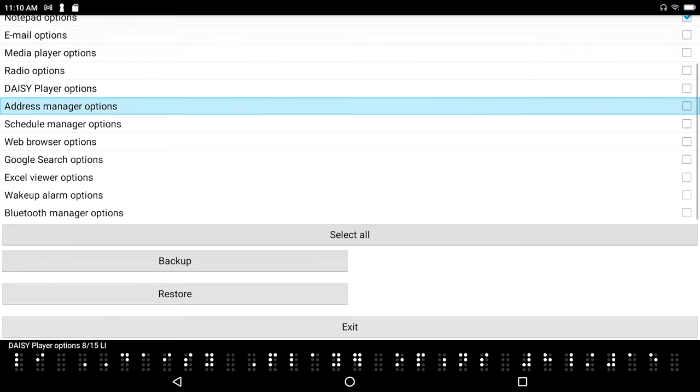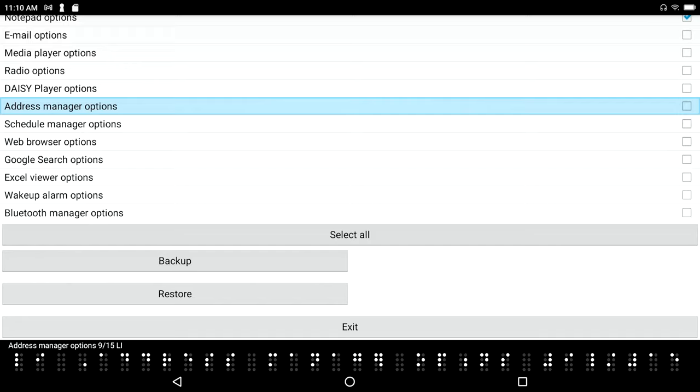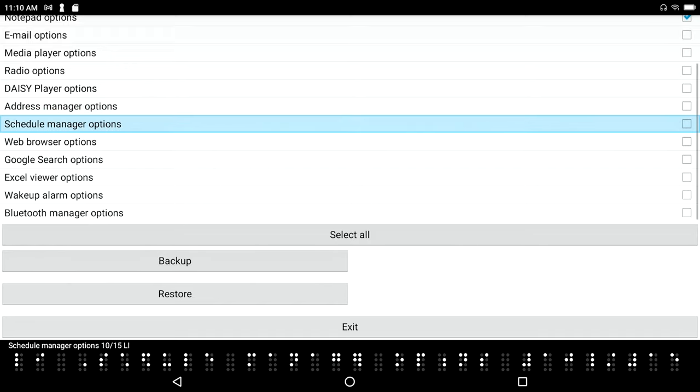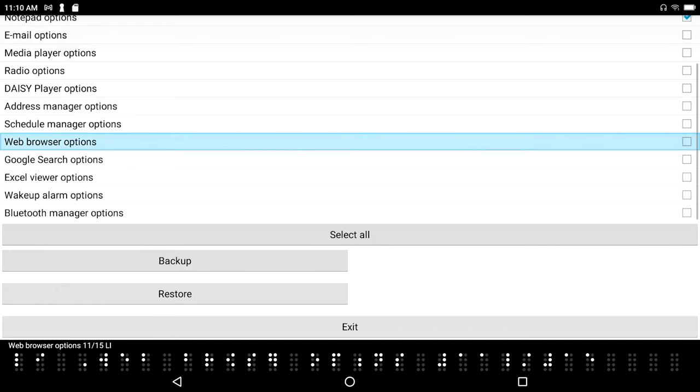Address manager options 9, so if you care about your settings, they should transfer over from the Polaris to the Braille Sense 6. Schedule manager options 10 of 15, web browser options 11 of 15. And for whatever reason if they don't, it's no big deal because you can always go back in and set this again and then do the backup on your new device.